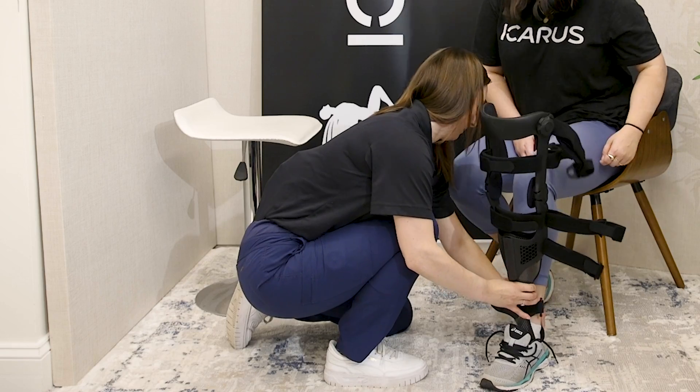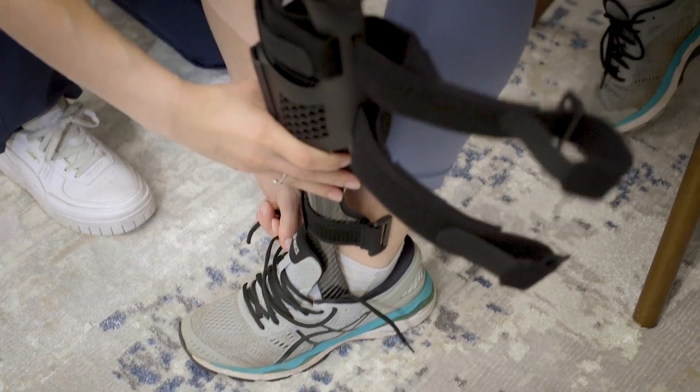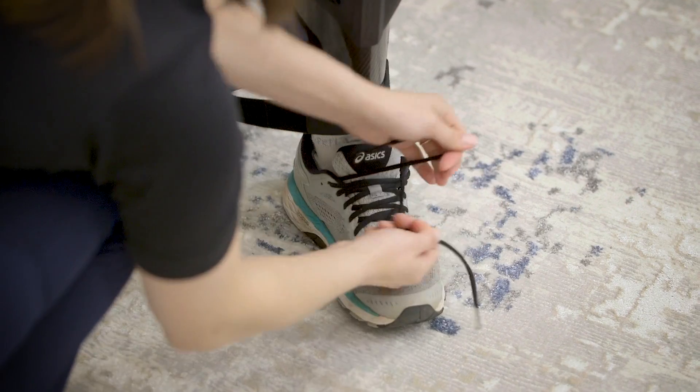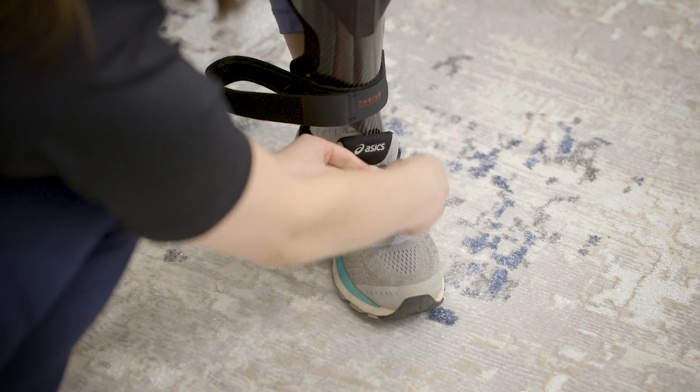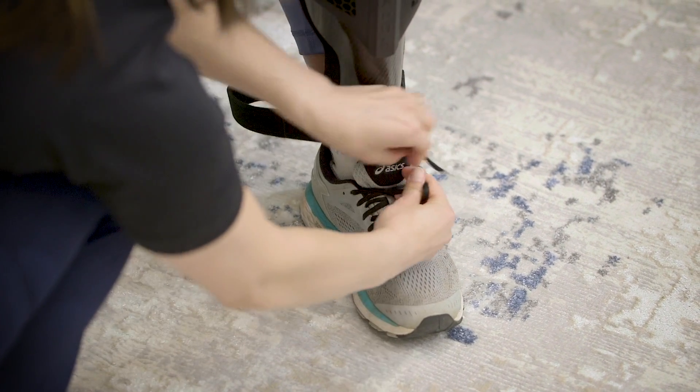Next, insert the patient's foot into the shoe and ensure a proper fit with the AFO is achieved. Slide their foot all the way back and secure their laces. The detachable portion will allow for the patient to wear either the device separately or combined, depending on the specifications of the order.